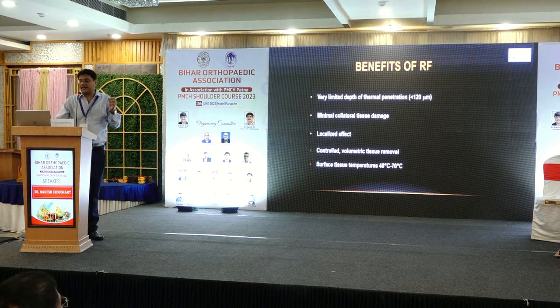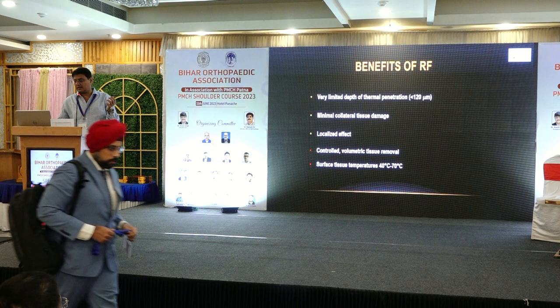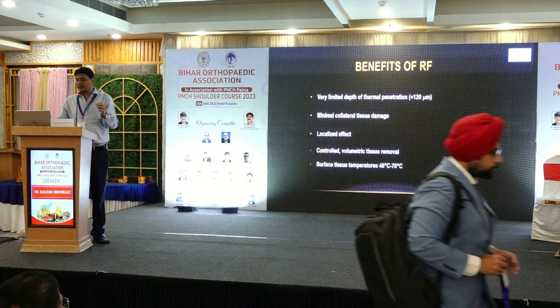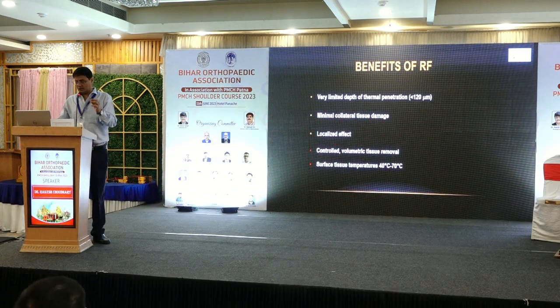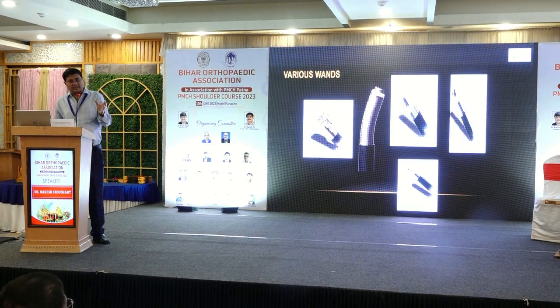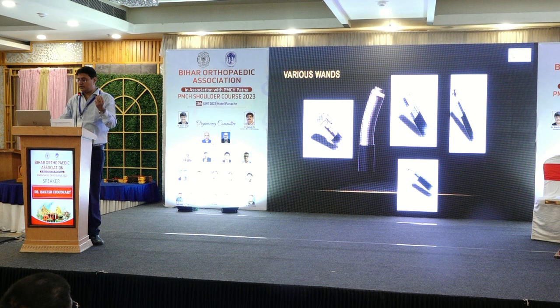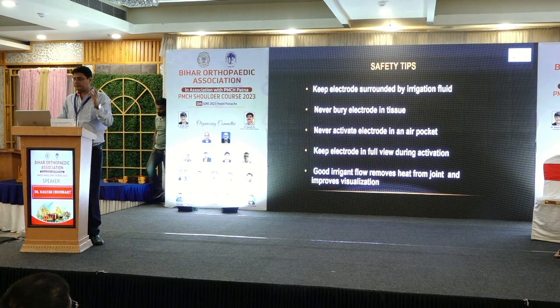The benefits are a very limited depth of thermal penetration, hardly 0.1 or 0.2 millimeter of destruction, minimal collateral tissue damage, localized effect, controlled volumetric removal, and very low surface tissue temperature. Various kinds of wands are available which you use for various surgeries. It is almost surgery specific what you use.